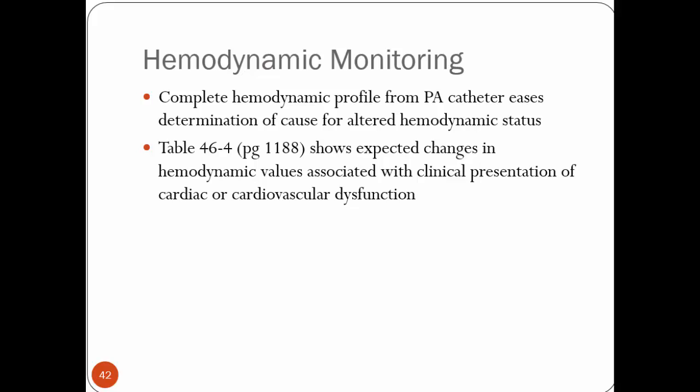Complete hemodynamic profile from the PA catheter makes it easy to determine the cause for altered hemodynamic statuses. The table on page 1188, table 46-4, shows the expected changes in the hemodynamic values associated with clinical presentation of the cardiac or cardiovascular dysfunction.